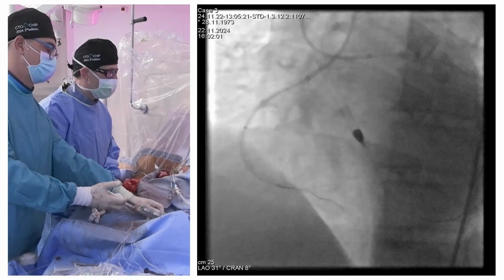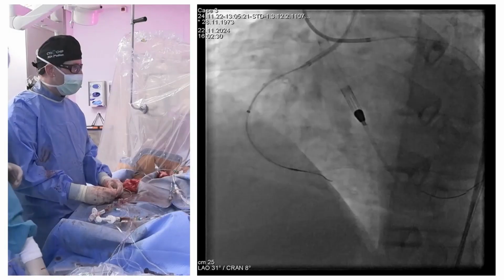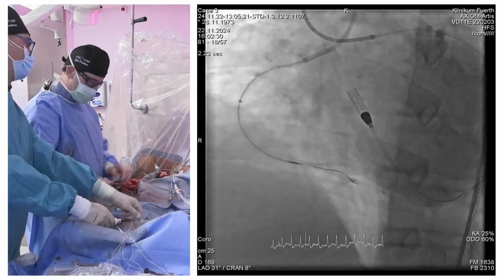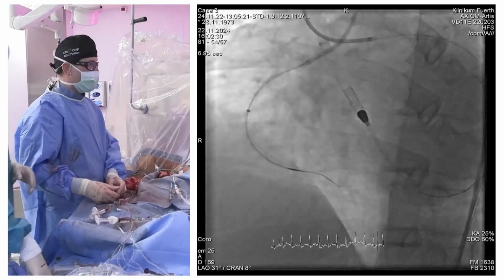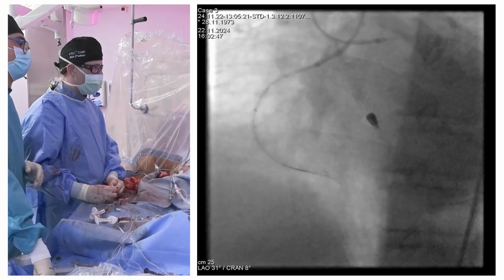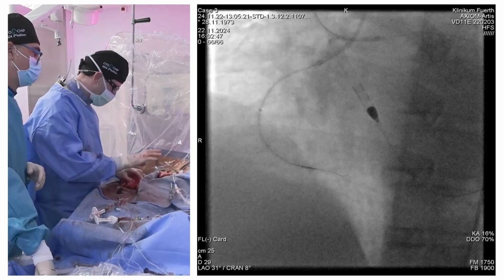I like to have a little more, so I usually load my patients after that with ticagrelor, but other than that, especially in the procedure, I would just stick with heparin because you could theoretically antagonize it if you have trouble with the groin. So I would not overdo it, especially not if you have the 14 French in there. It's fine right now. We have a little hematoma on top of the sheath, but so far it's relatively well.